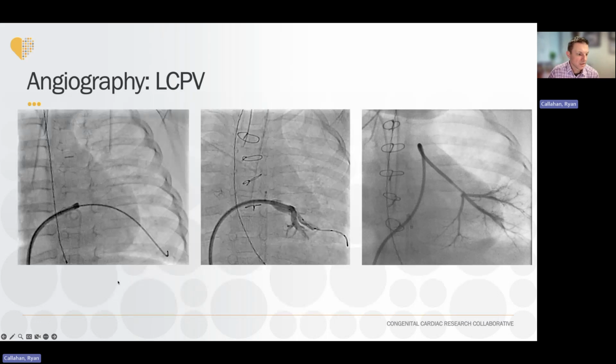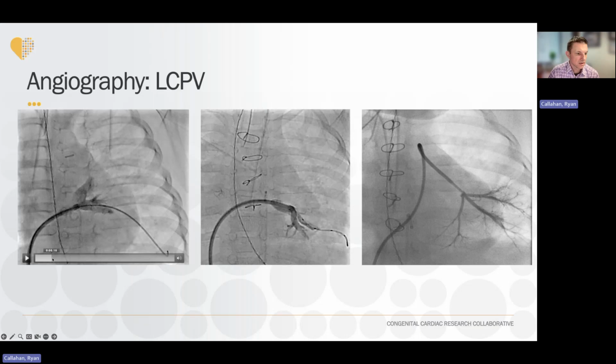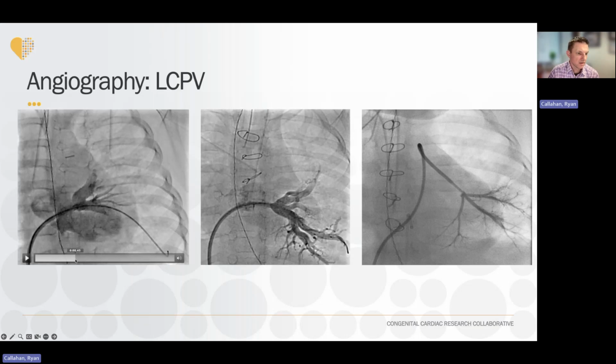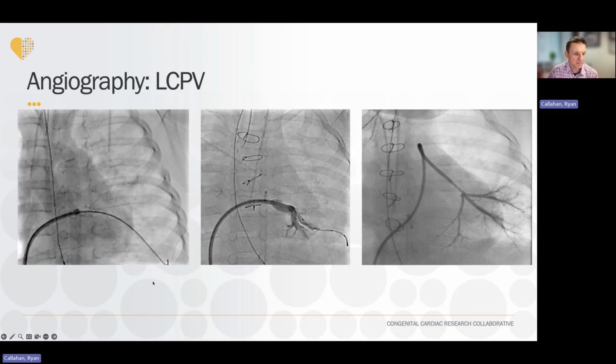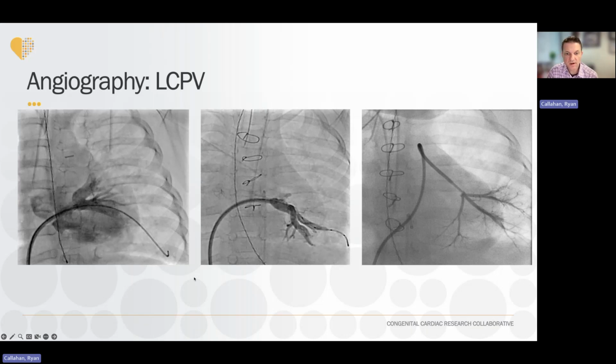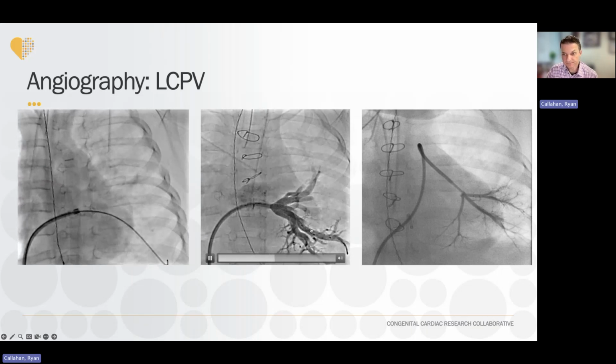Okay, how about the left? All right, here is a left common vein. So all the veins from the left lung coming back through this orifice here. The sheath doesn't block it, and you have to look at it a few times, but it's not severe. It's going to be about moderate, 50%, normal to moderate. This, however, is more severe in the left common.